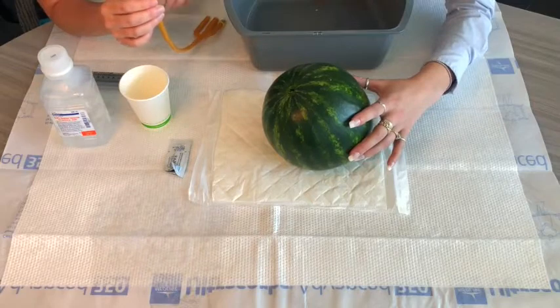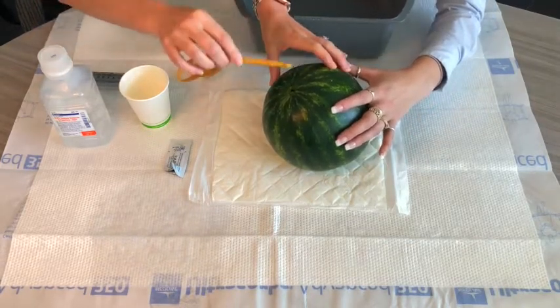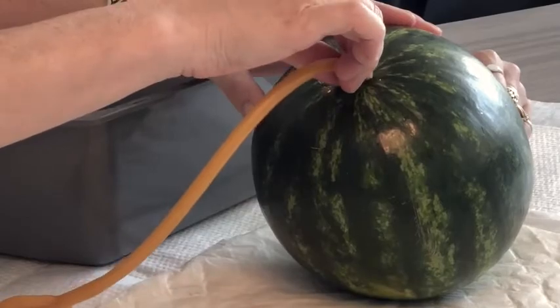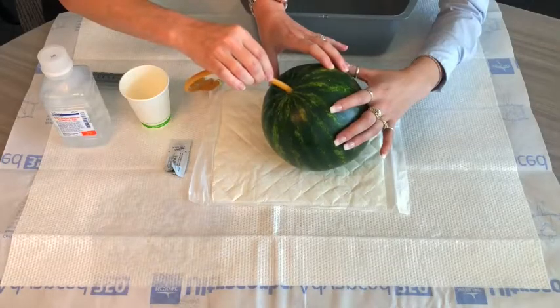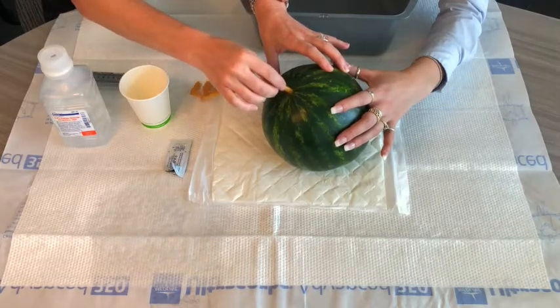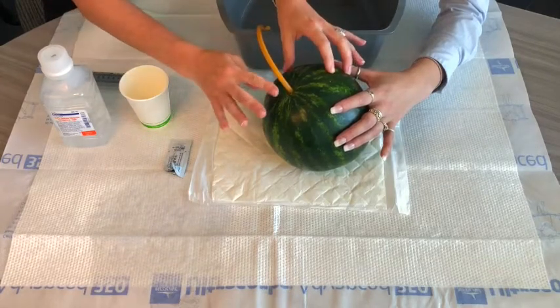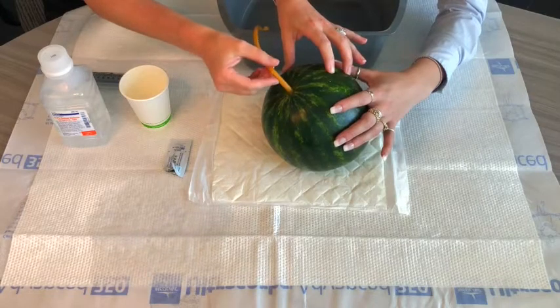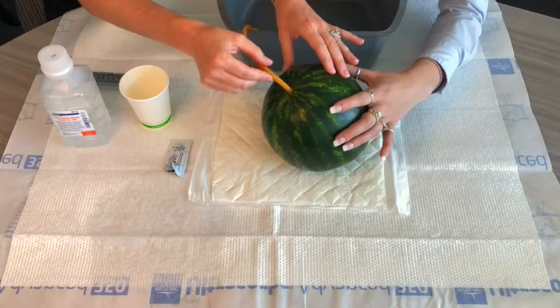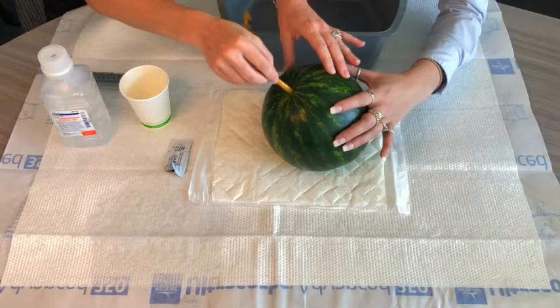You have your catheter in your hand and one hand is on the baby's feet. Find the rectum and advance the catheter. You may meet a little resistance initially — just hold your catheter in place until your baby relaxes and calms down. Once that happens, the catheter can be advanced about six inches. You may have pockets of air that drain out as well as pockets of fluid into your basin — both are acceptable. Fluid that leaks out around the catheter is also okay.